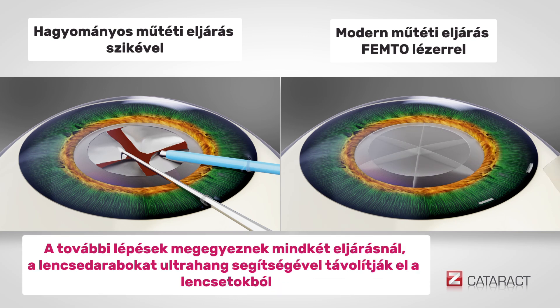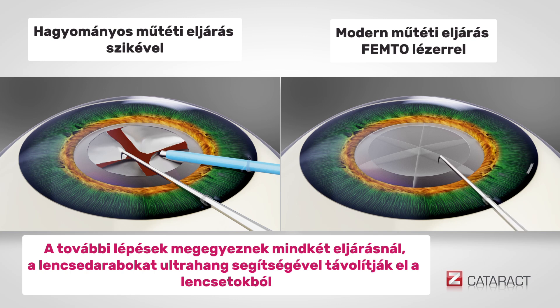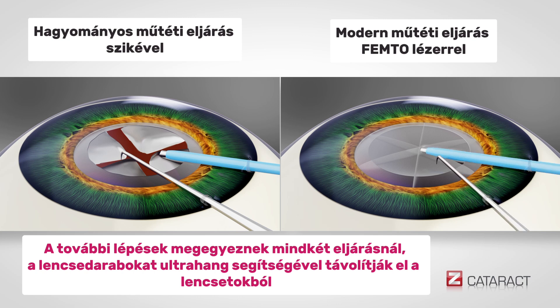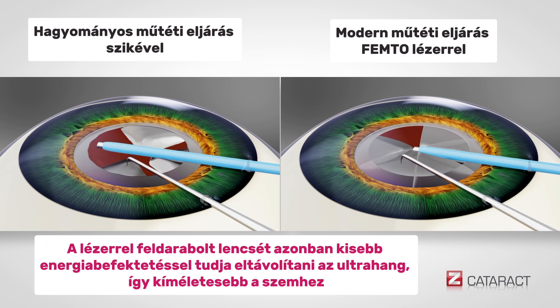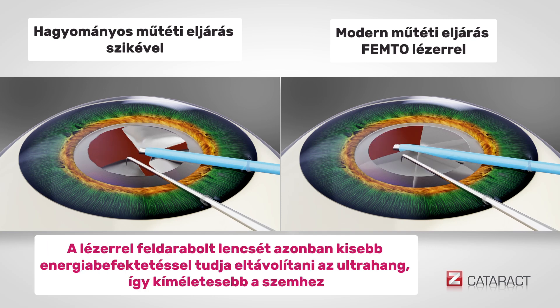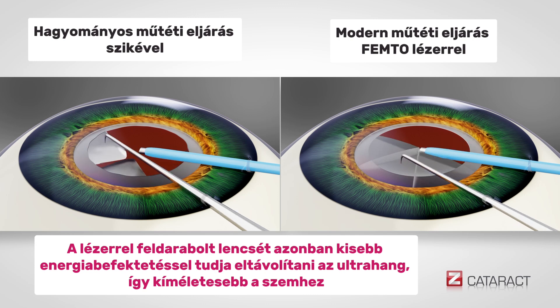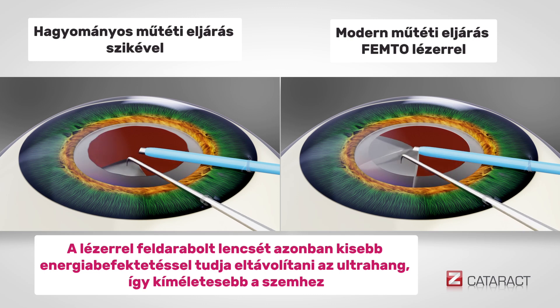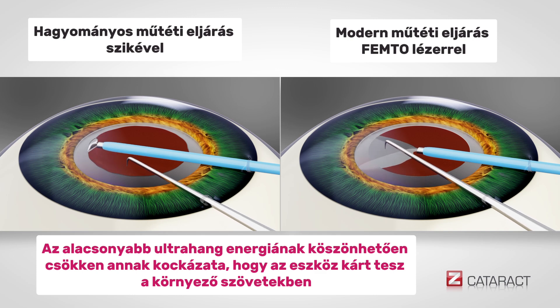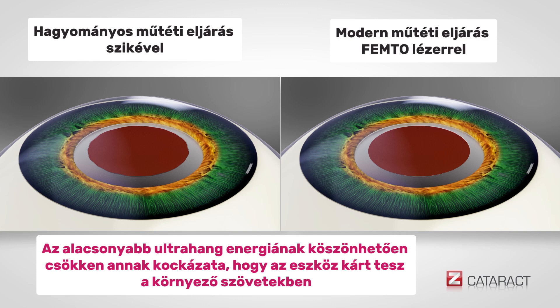With both traditional and modern Z-Cataract laser surgery, the smaller pieces of the lens are then aspirated and removed from the eye. The pre-fragmented segments created by the laser make it easier to remove the lens with less energy from the phaco tool, thus contributing to a much gentler procedure. This enhances the ease of lens removal, but also potentially diminishes the possibility of the phaco tip damaging surrounding tissue.